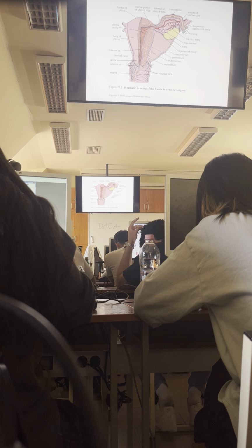And if you think about the role of this uterine tube, obviously the egg cell, if it is swept into the lumen, has to be transported towards the uterus.